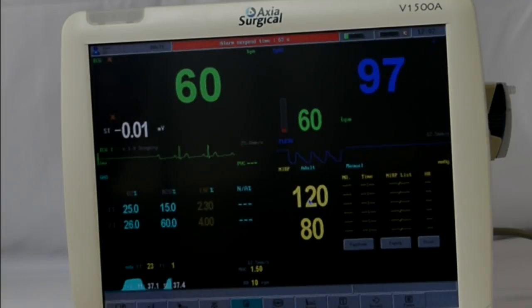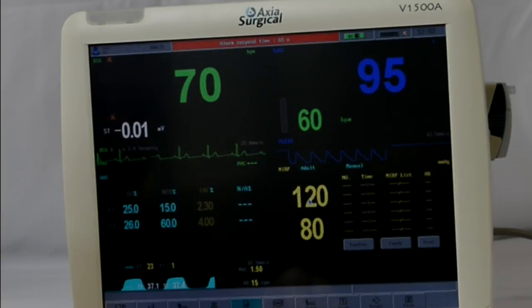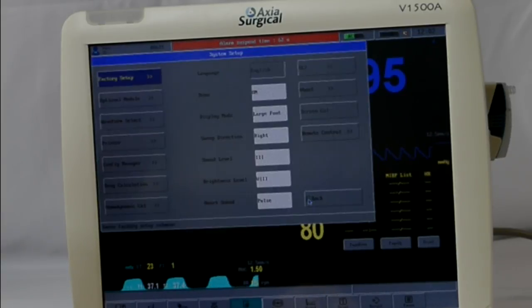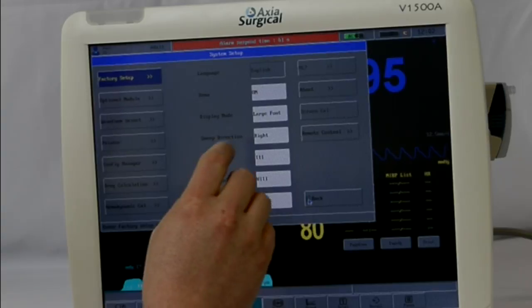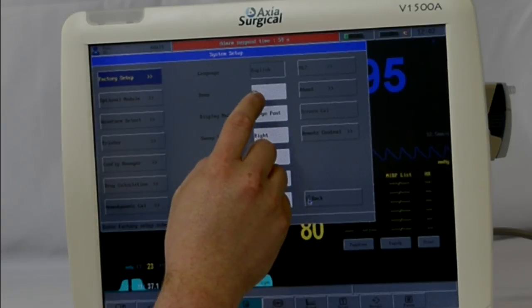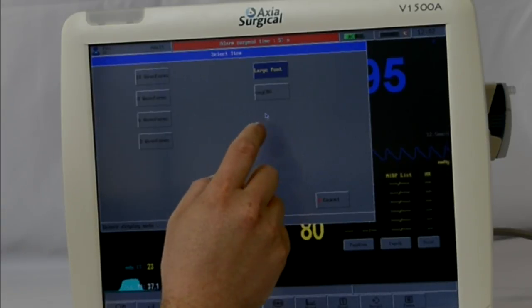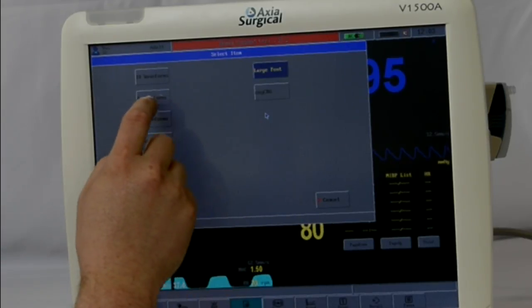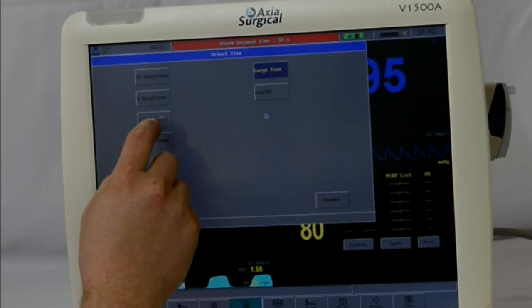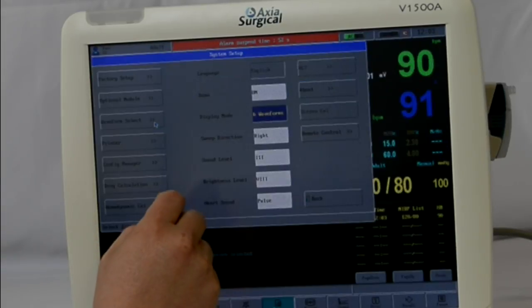An additional feature that might be useful is changing the amount of wavelengths that are on it. Return back to the setup button, and then underneath demo you see display mode — press that. You can toggle between three, six, eight, and ten waveforms.